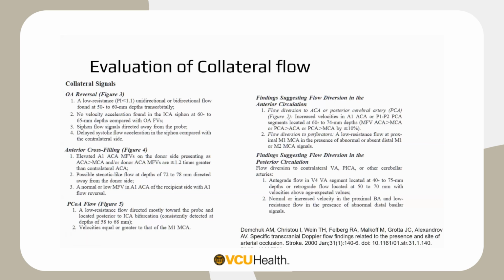Additional collaterals that you could try to assess with TCD are flow diversion, which is basically looking at compensatory increases in, for example, an ACA in the setting of an MCA occlusion.